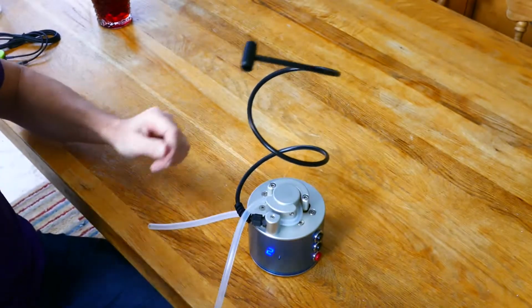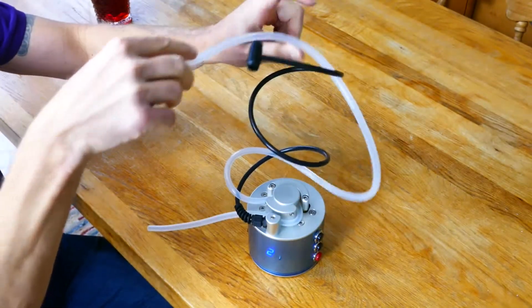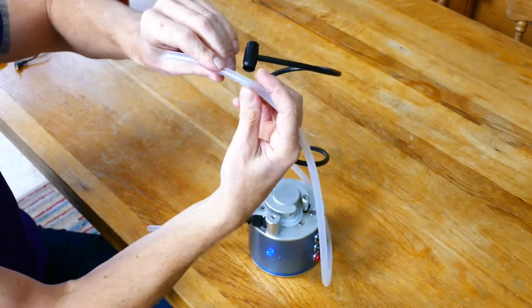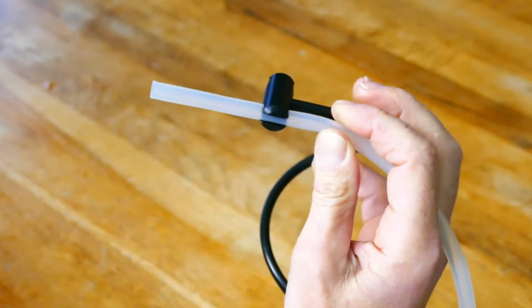The straw is then clipped into the straw holder. So I'm going to do that by giving the straw a bit of a stretch as I'm pushing it in, and it just goes into the gap nicely.